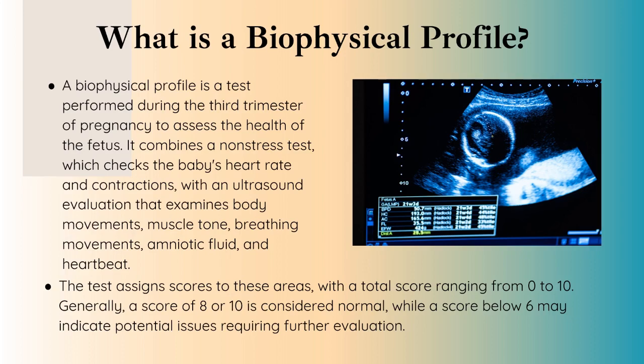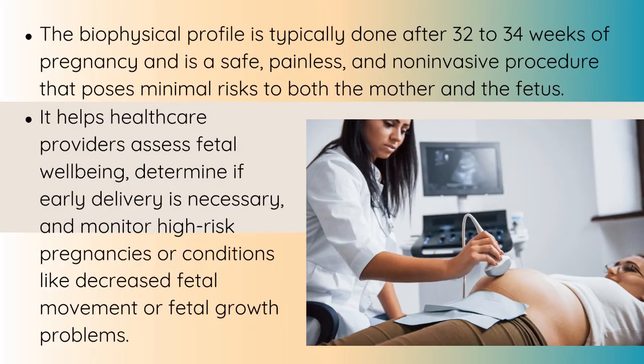further evaluation. The BPP is typically done after 32 to 34 weeks of pregnancy and is a safe, painless, and non-invasive procedure that poses minimal risk to both the mother and the fetus. It helps healthcare providers assess fetal well-being, determine if early delivery is necessary, and monitor high-risk pregnancies or conditions like decreased fetal movements or fetal growth problems.